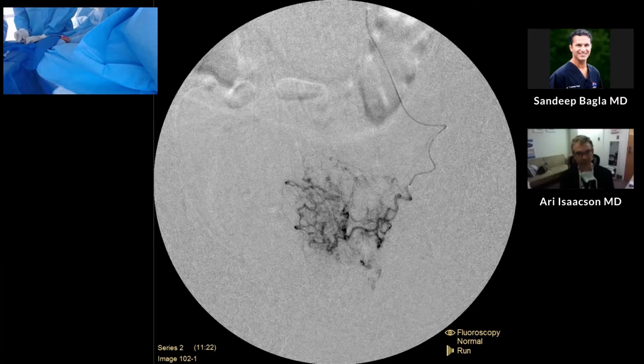But back to what you were saying, in terms of height and radial access and catheter length, this catheter tends to come in 175 and in a shorter 155 length. Here we chose, I don't know if you can see this well or not, but we chose the shorter 155 length because for his height, we don't need the 175. If we were doing your PAE, I think we'd probably have to go to the 175.